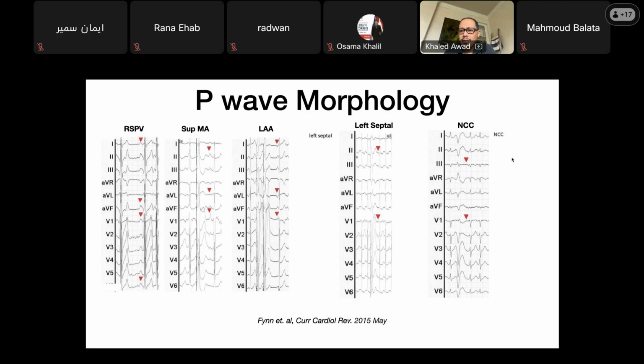Obviously here, you've got to be careful around the conduction system. If it is in the non-coronary cusp, it is so much better to approach it there than to try to do it from the right atrial side of that part of the septum, because then the risk of heart block becomes a lot higher, and you probably will not be able to get to the tachycardia.